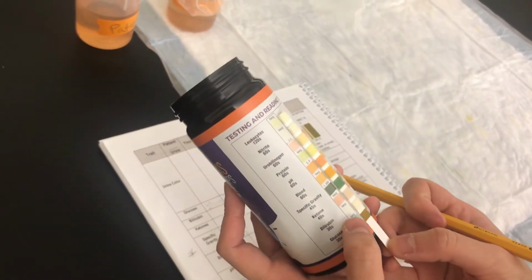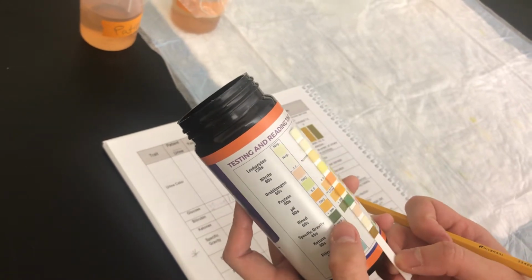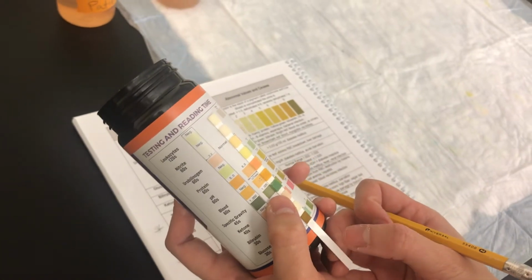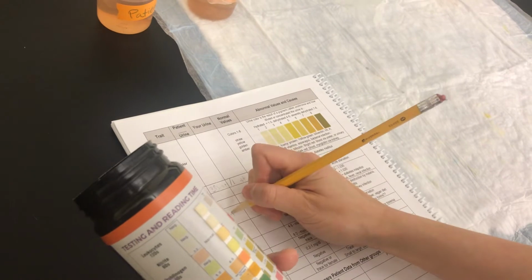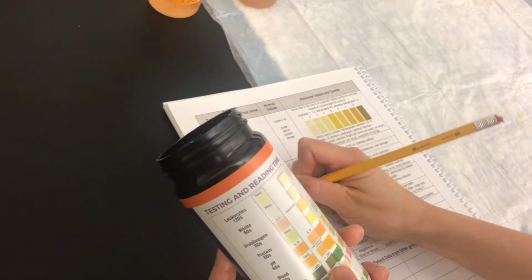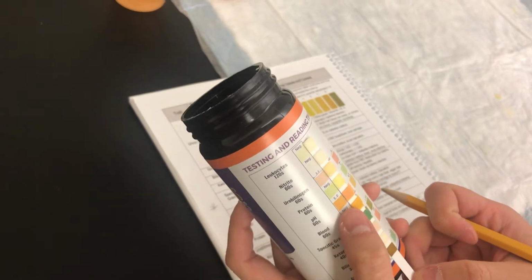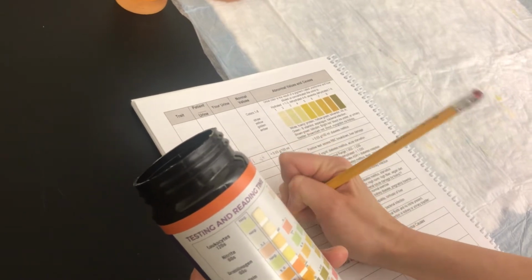Now I'm going to move up to bilirubin. That looks normal. It looks the same. Ketones look the same. Specific gravity. Okay, let's see if we can figure that out. That looks kind of greenish, so I'm going to say 1.005. Okay, do we see the presence of blood? No blood. Let's take a look at pH. It's pretty bright, so we're going to go with 5.0.